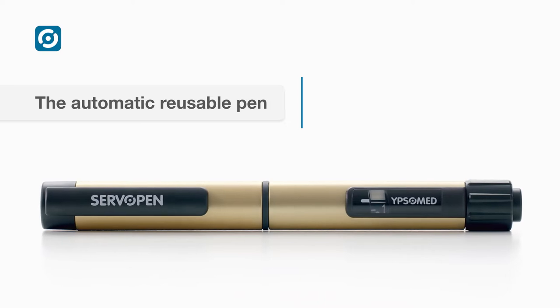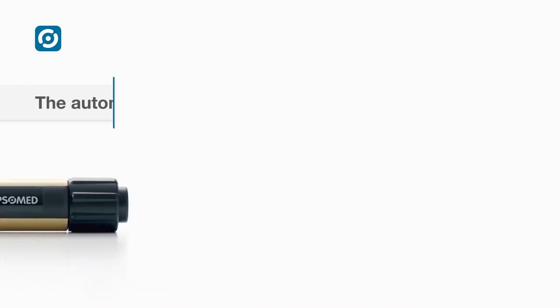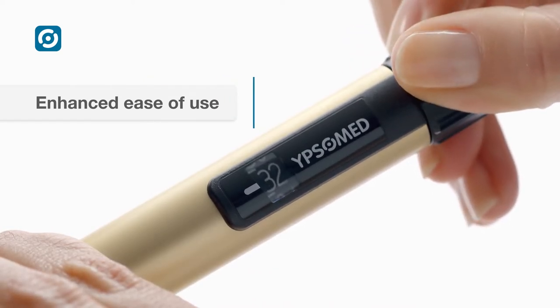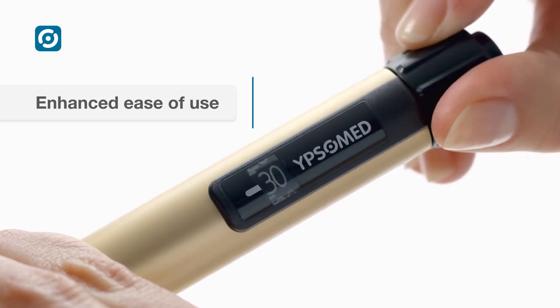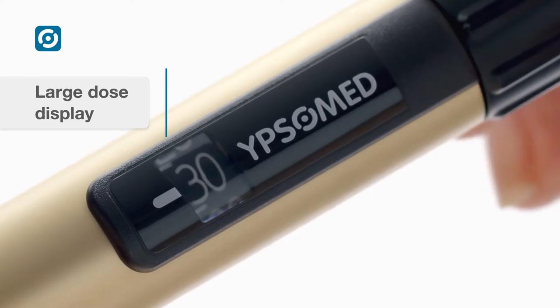ServoPen is a universal device for insulin and other cartridge-based therapies. ServoPen has a proven handling concept based on easy dose dialing and correction to enhance the user experience. The large dose display provides easy to read numbers.